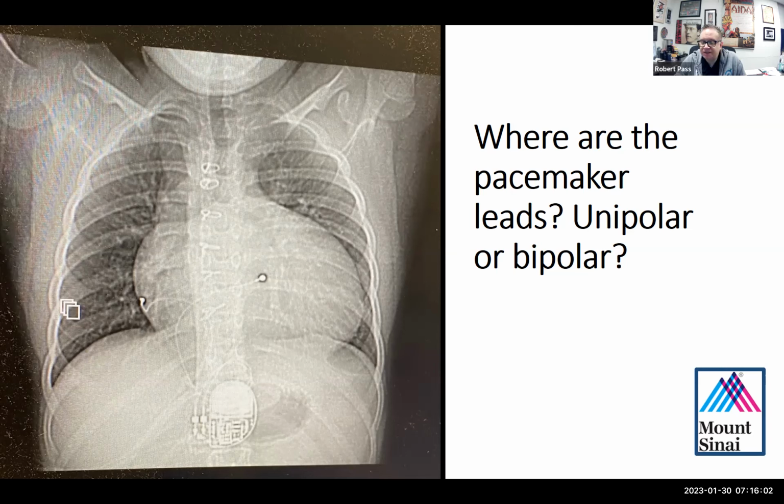It's not a great pacemaker, but it is great for a patient who's really, really tiny and whom you're very worried about that. The device requires a bipolar lead in order for it to be effective.